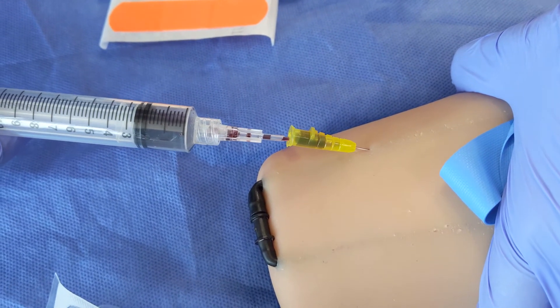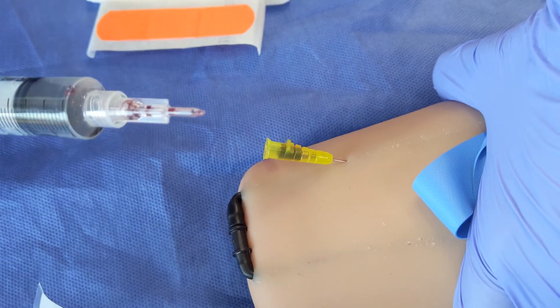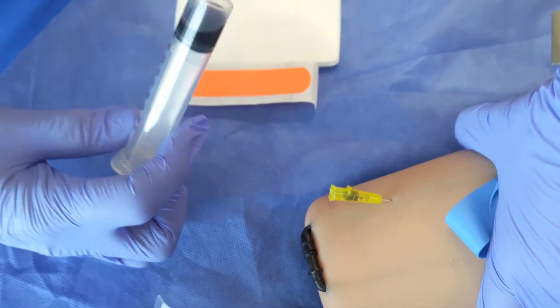It does take a little bit of time sometimes, so you have to be patient. But you just insert that blunt cannula into that hub and it'll happen. And kind of check and see where you're at.